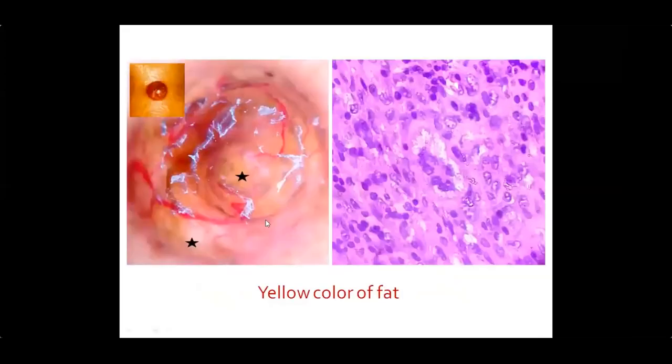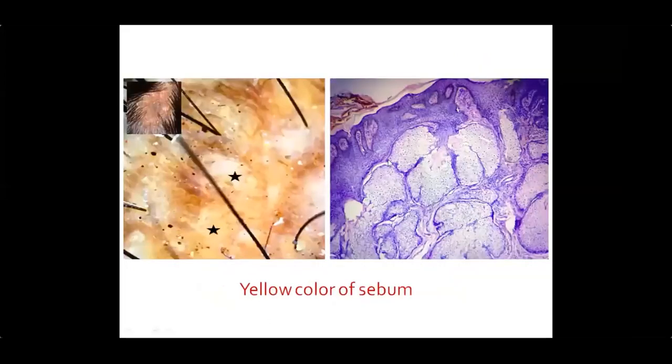This is the yellow color of fat. This is a case of xanthogranuloma, and the yellow color is because of the xanthomatized histiocytes. And this is the yellow color of sebum. This is a case of nevus sebaceous of Jadassohn, and the yellow color corresponds to the mature sebaceous glands in the dermis.